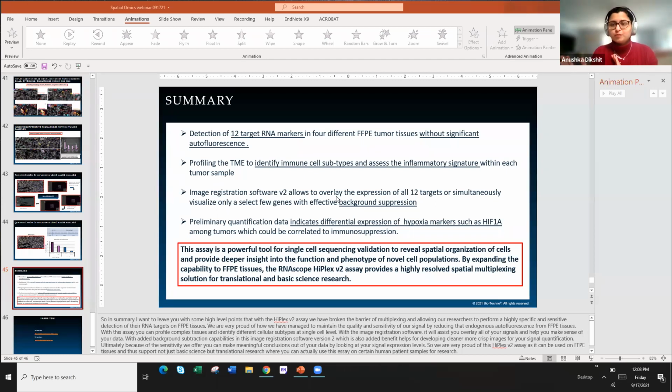I was talking purely from a probe design perspective: all the parameters we have to meet for the probe design are pretty uniform for each target, but there are so many other variables, like sample quality and protocol technique, that can definitely impact. I have done a homebrew-ish assay during my PhD, where I cloned the probes and did everything myself, and that required an RNase-free environment, and I had to wipe down the incubator from top to bottom. I think we've really come above all of that with this assay, where you just need a simple lab with no stringent conditions, really.